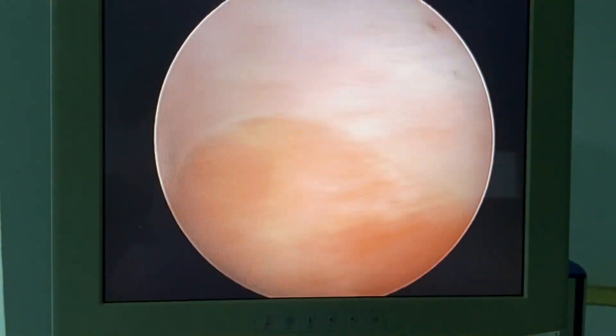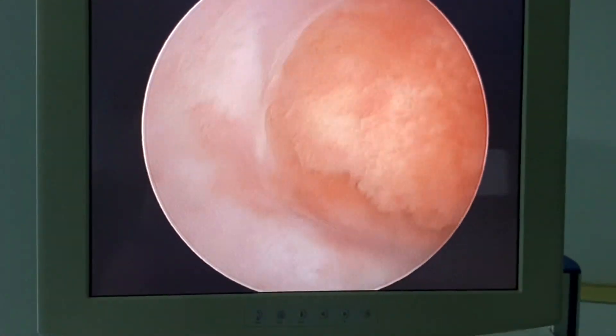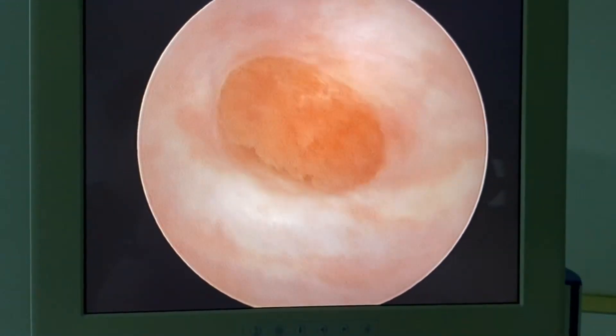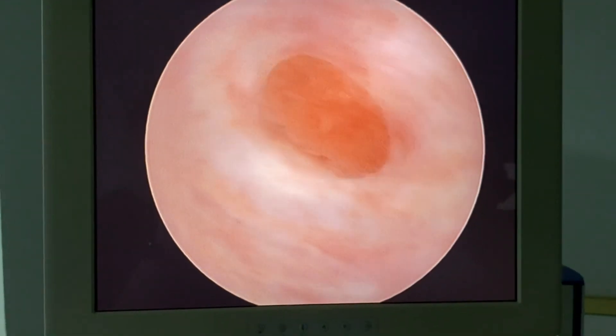This is a large cervical ectropion. This is the stratified squamous epithelium, this is the columnar epithelium, and this is the transformation zone. This is my vaginoscopy technique, which allows a very nice examination of the vagina — much clearer, more comfortable and convenient to the patient, and better than colposcopy.